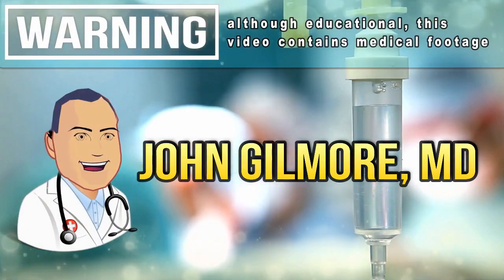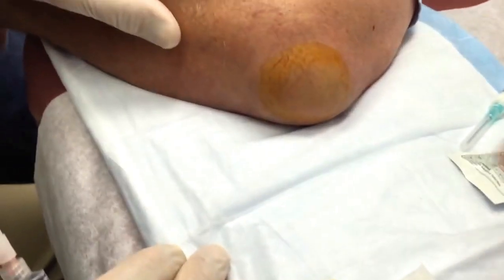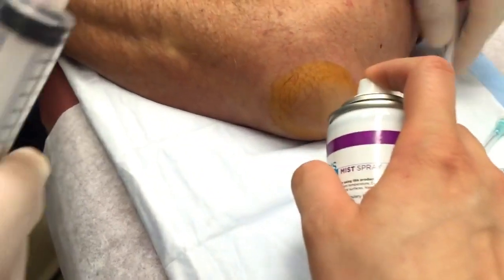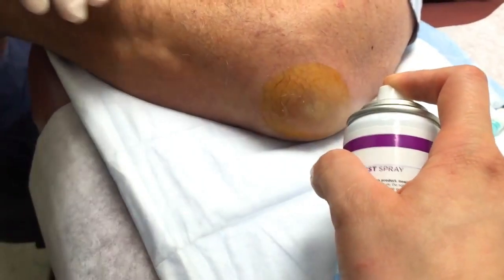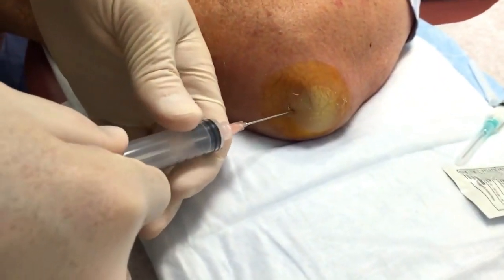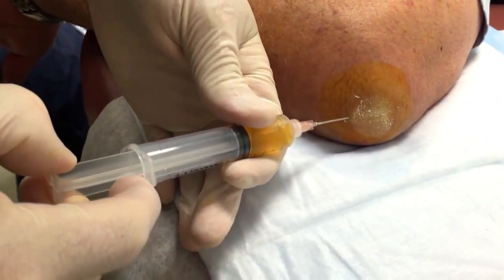We're gonna use a cold spray, we're gonna actually chill this real good. Okay, your hair looks fine, it's not gonna be in the video. We're gonna see if we can get some fluid out of there. Yeah, she would, a little stick — okay, I don't want to hurt you.